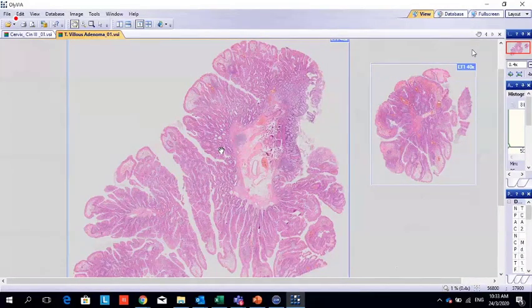But villous adenoma is more precancerous. So some pathologists like to report it as tubulovillous, because even if the villous component is less, they like to mention it since it is more precancerous than tubular. I mean, both are precancerous, but villous can progress to cancer more easily than tubular. Okay.